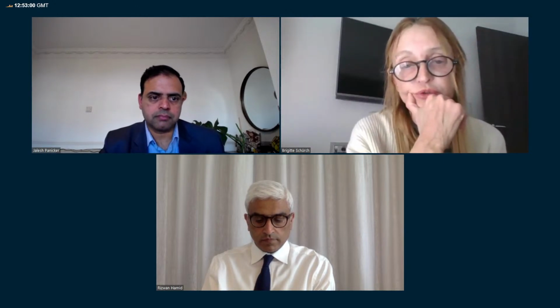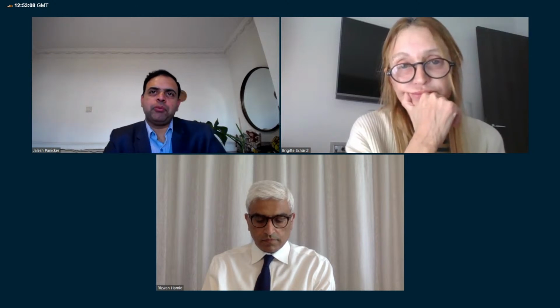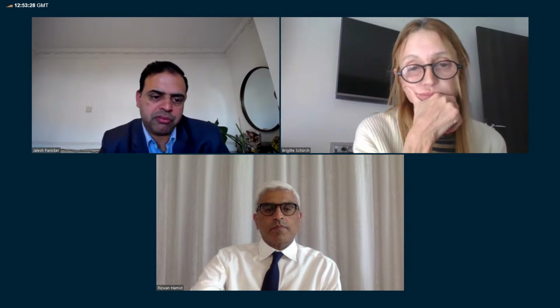If you want to classify your investigation, what will be for you the most important for a neurogenic bladder? That's a very difficult question. I would say that if it's just a pure bladder dysfunction, it's more for the ones with voiding dysfunction rather than storage dysfunction that I think there would be a role for pelvic neurophysiology. And in that context, if you were to ask me to say one specific test, it would probably be a urethral sphincter EMG in a woman with retention.